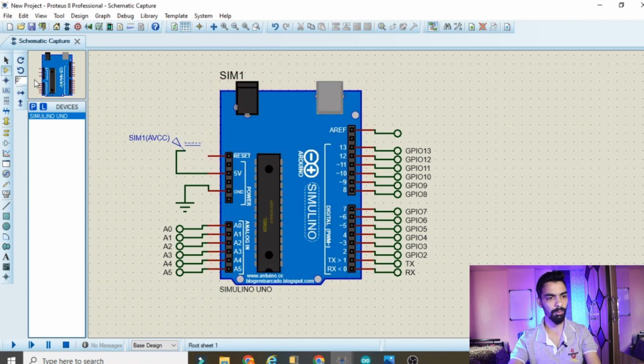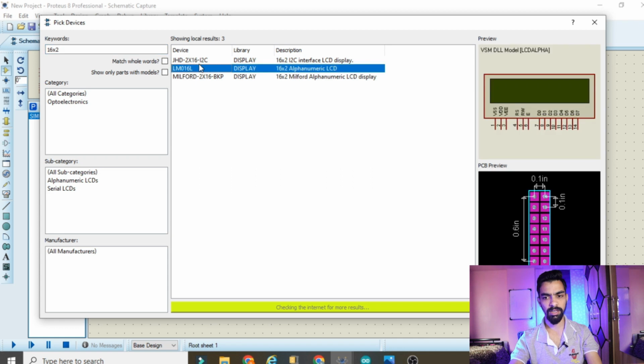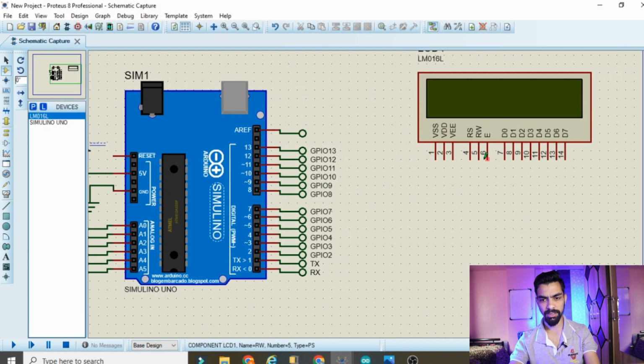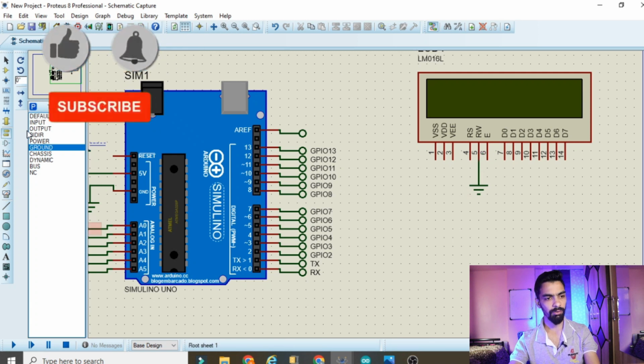Again go to the component mode, then click on P and type here 16 cross 2. Once you type 16 cross 2, select this 16 cross 2 LCD. Click on OK and place that LCD here. Then you can see the RW pin should be connected to ground first. So go to terminal mode, then click on ground and place the ground here and connect that ground to ground. Then we require some default pin.